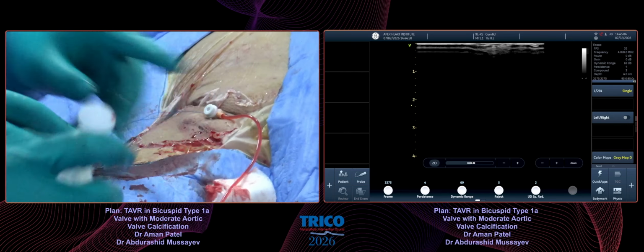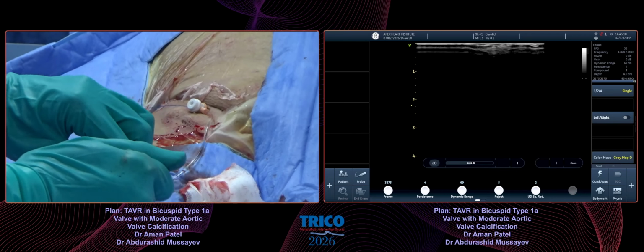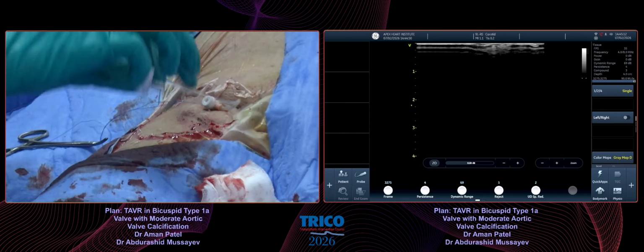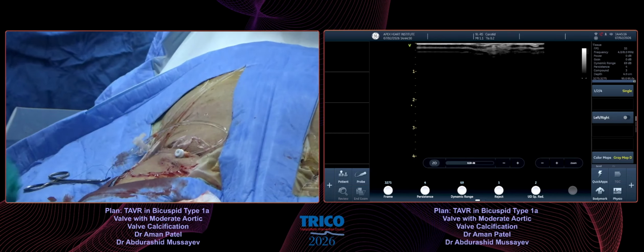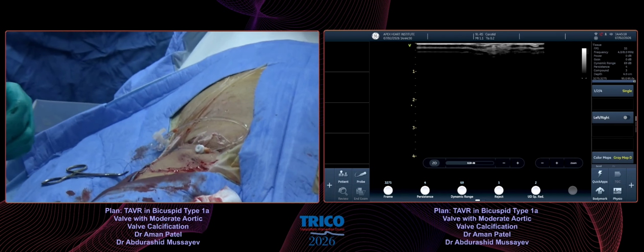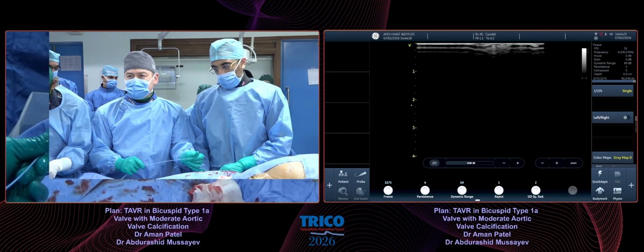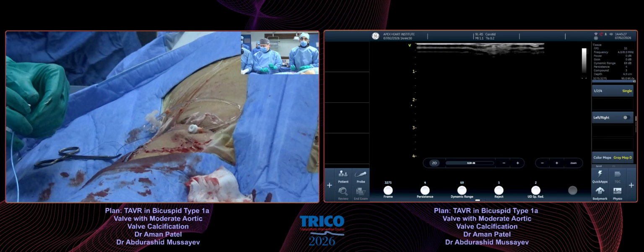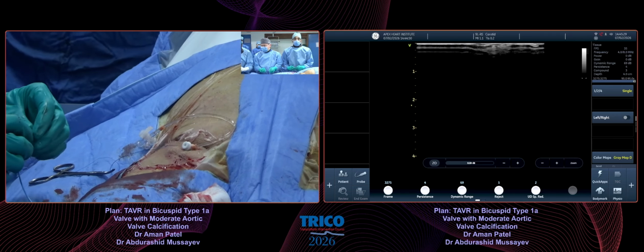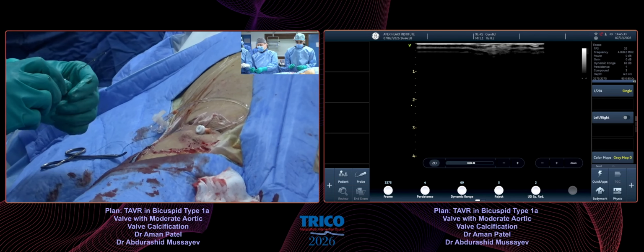Okay, good. So, Kintur, it has now become almost like a standard. I don't know, Dr. Girish will tell us and others also. One ProGlide and one angioseal has become the standard of practice in most of our places. And sometimes even one ProGlide also. And most of the time you're reversing happening over here. So even one ProGlide also suffices. What do you say, Dr. Girish? True. I think it depends on where the bifurcation is.